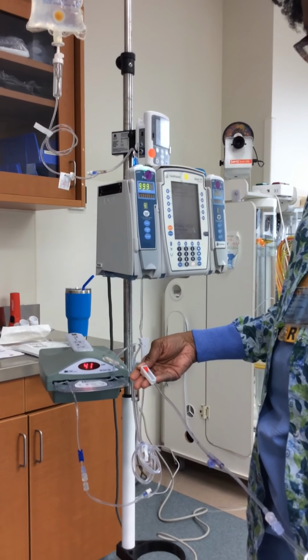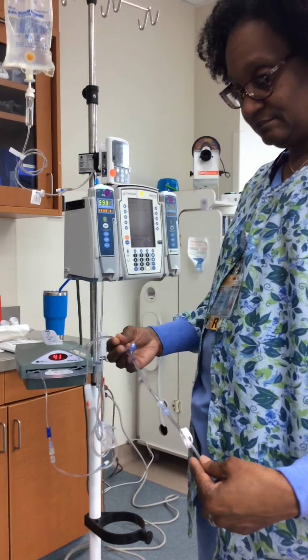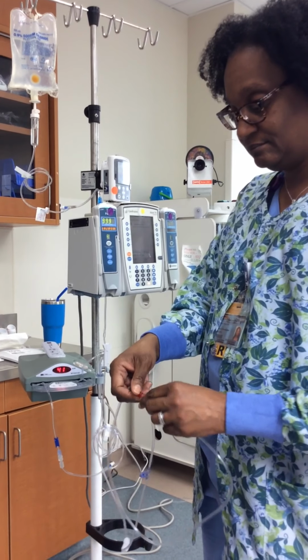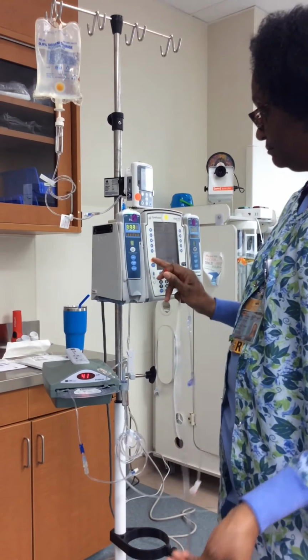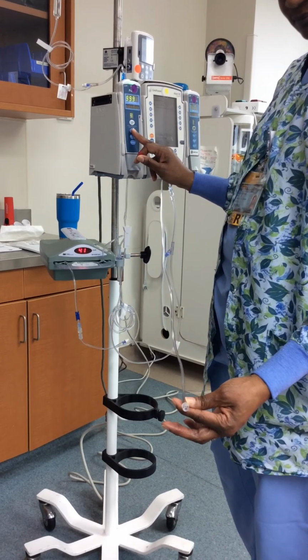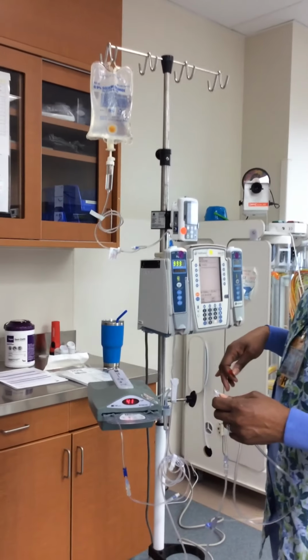Once it primes all the way down to the end, you'll see that the cap on the end of the tubing is red for heated fluids. This is going to go ahead and plug into your patient's IV or central line so that the fluids can go ahead and start infusing into the patient. So that is the setup of the Ranger warmer.